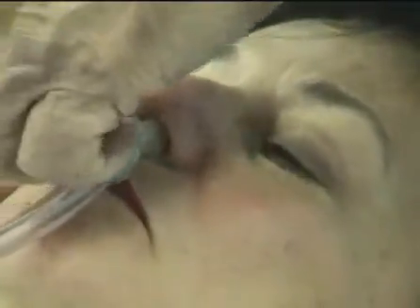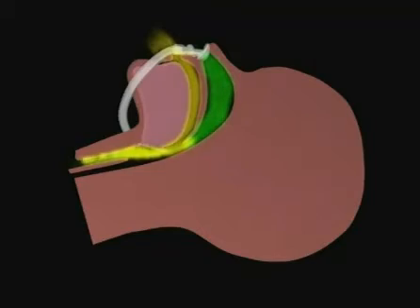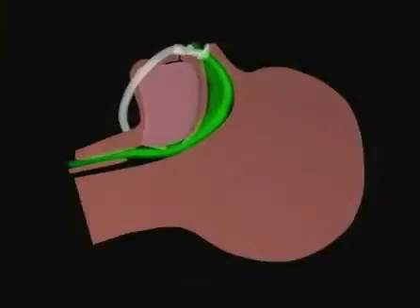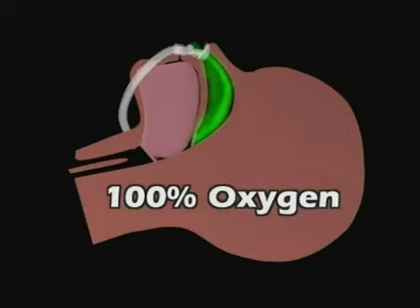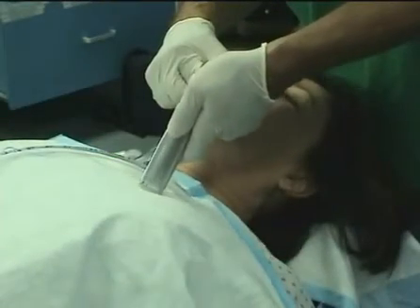The SNORTAL may be applied to an awake patient to spontaneously pre-oxygenate and denitrogenate the lungs, as 100% oxygen forced through the nose pushes nitrogen out of the mouth. Then, when anesthesia is induced, CPAP is established to keep the airway open and to allow spontaneous respiration. If the patient becomes apneic, the delivery of 100% oxygen above the vocal cords will provide for apneic diffusion oxygenation. This will keep the normal patient well oxygenated through many minutes of a difficult intubation.